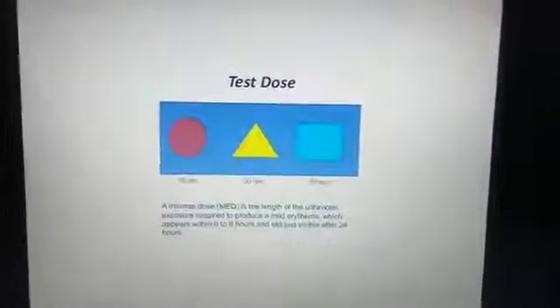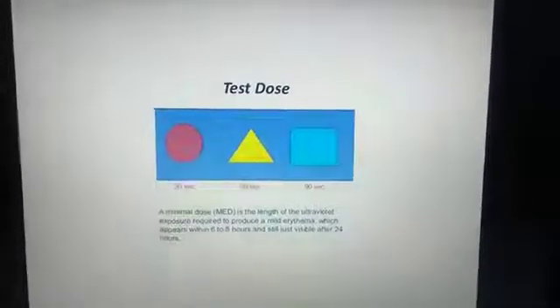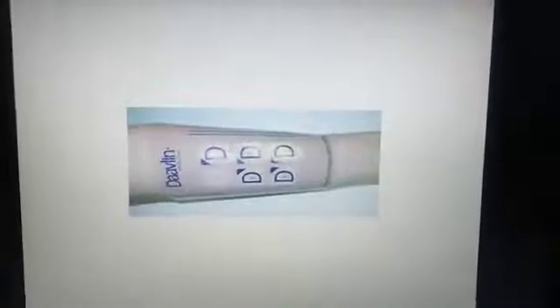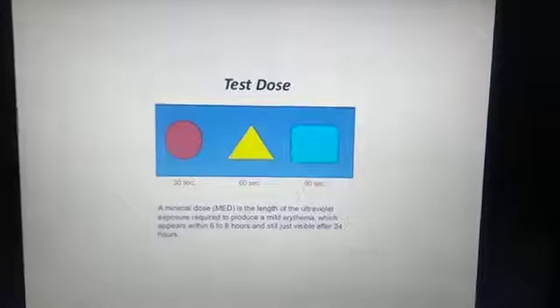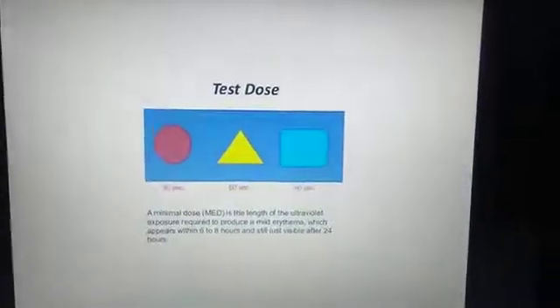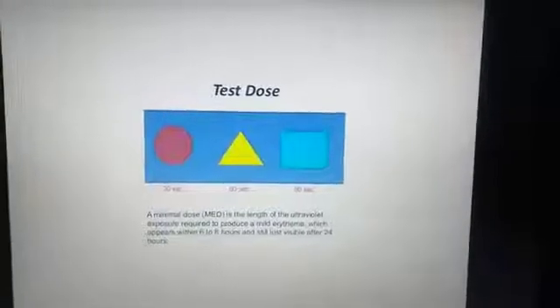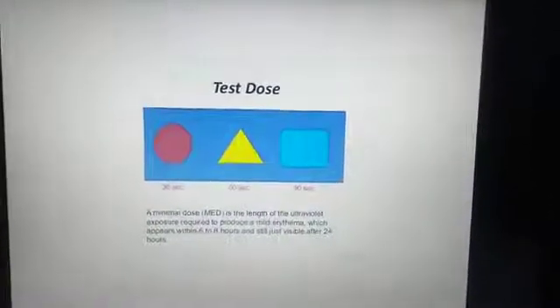Now going ahead with this, to do the test dose we have two things. One is this sample and another one which is running right now in other parts of the world is this one, the Devlin patch. These are the testing apparatus. We put this, which can be made up usually with a linen cloth or maybe a cardboard paper also. Then you can see three shapes are there: the circular, the triangular, and the rectangle.